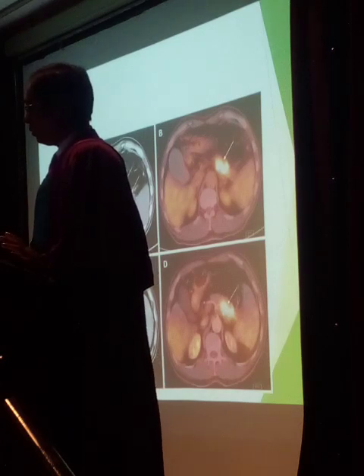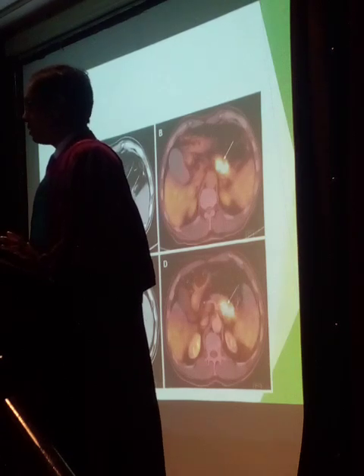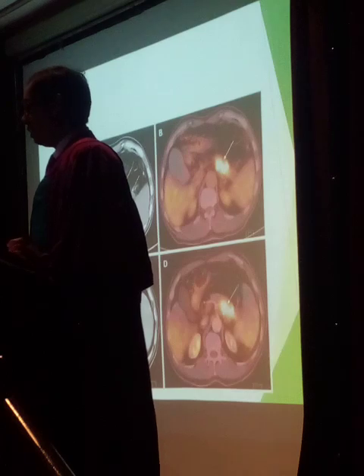What we can do when we manage the patient palliatively, as Ranga said, if biliary obstructions are there, we can put in a stent using ultrasound or CT. We can puncture the bile duct and put a stent and relieve the symptoms.